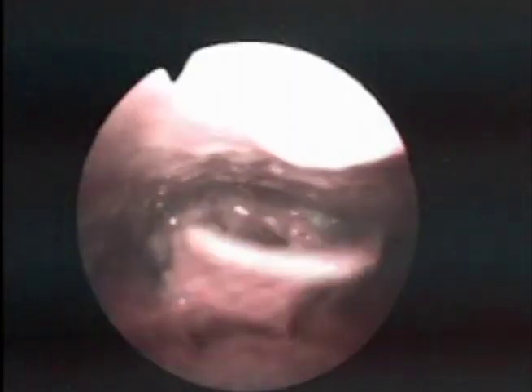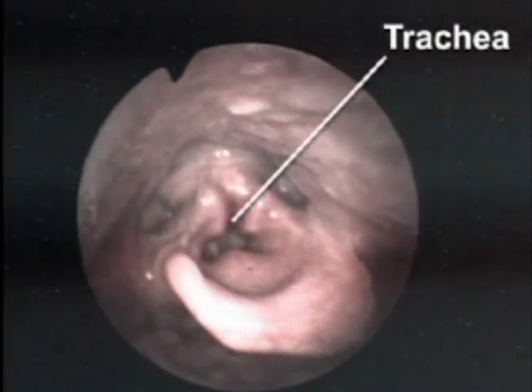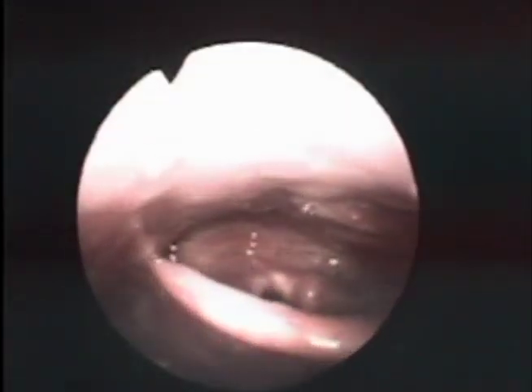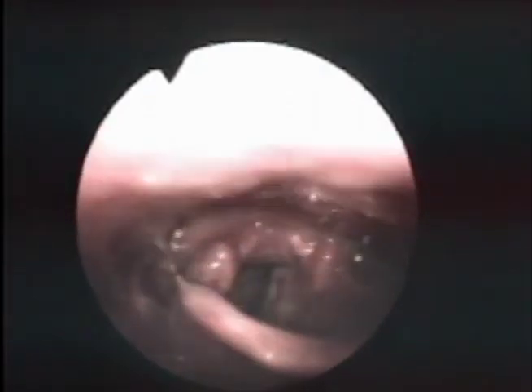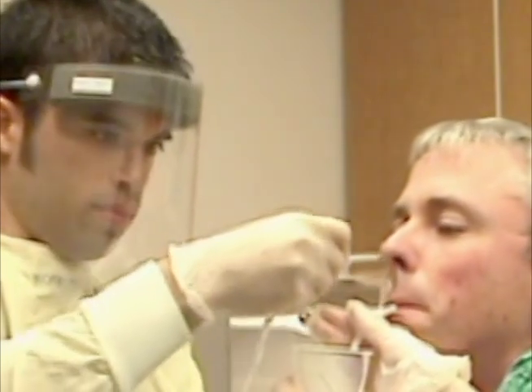As the tube reaches the level of the larynx, advancement is temporarily halted. The tube is then inserted as the patient swallows, and, once past the larynx, is rapidly advanced. Note that in this endoscopic view of the larynx, the trachea is frequently open and may be accidentally intubated with an NG tube. Note also that as the patient swallows, the laryngeal apparatus arises and the epiglottis covers the glottis, preventing tracheal entry. Once past the larynx, the tube may be inserted rapidly to the predetermined depth.